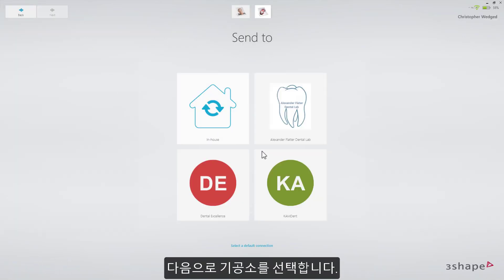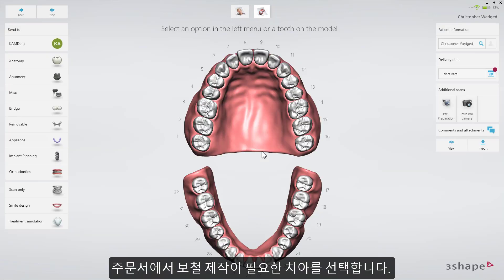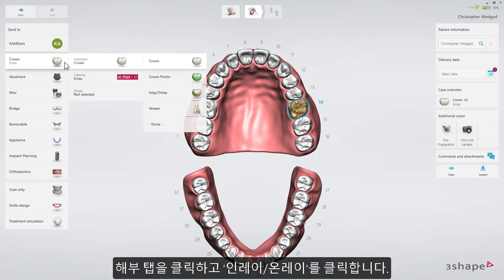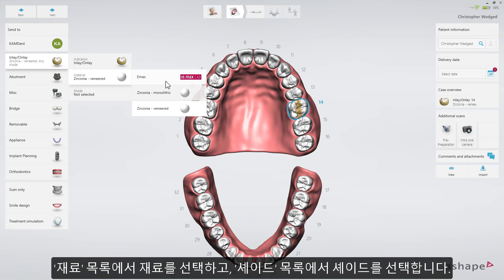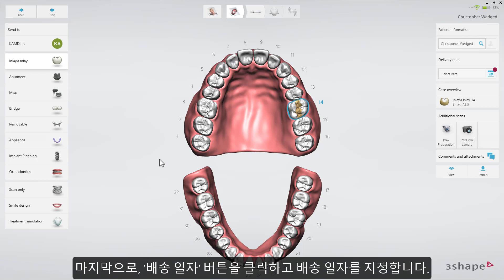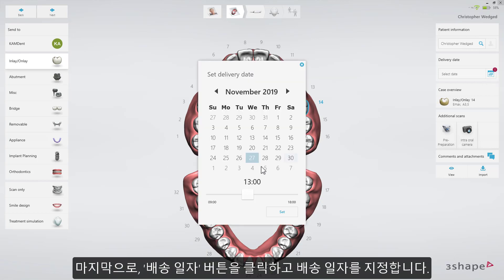Next, select a lab. On the order form, select the tooth on which the restoration is planned. Select the Anatomy tab and select Inlay-Onlay. Select Material from the Material drop-down list, and select the Shade from the Shade drop-down list. Finally, set the delivery date by clicking the Delivery Date button.